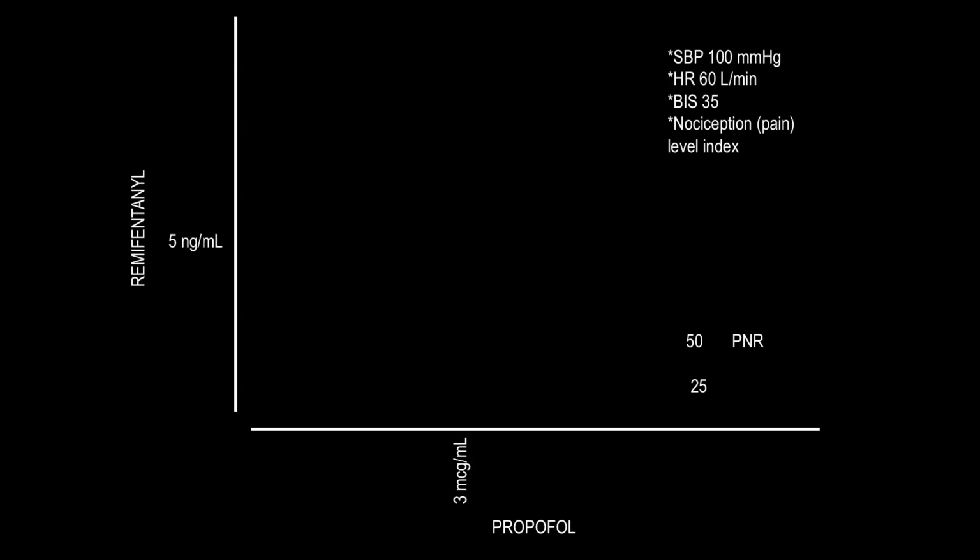If we bear in mind that when administering remifentanil and propofol, they interact in a synergistic manner, and that the TCI system does not integrate the information of said interaction, it simply responds to the infusion for the concentration that we choose. As we see in the graph, the TCI systems and some simulators will only allow us to move on the 2 axes. This is the main shortcoming of these systems.